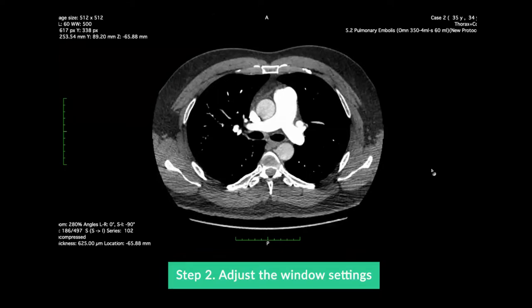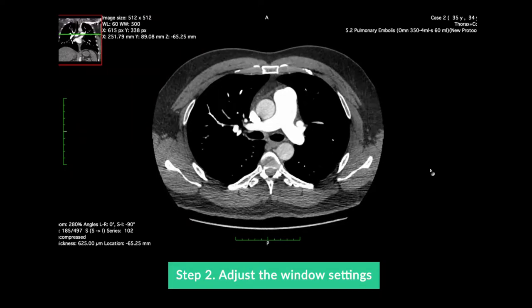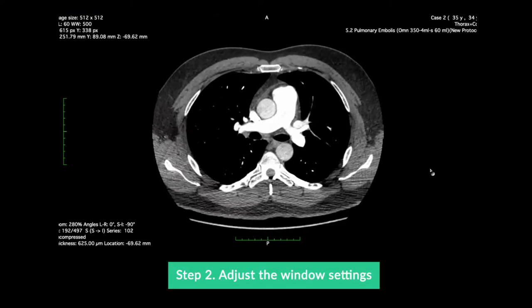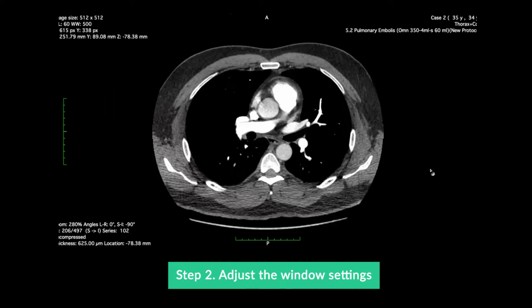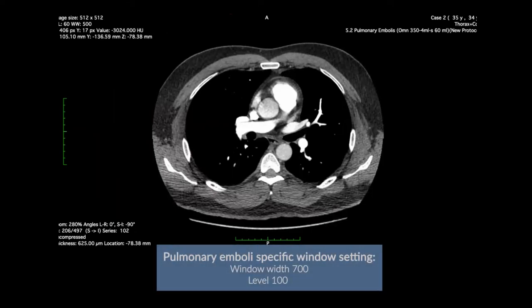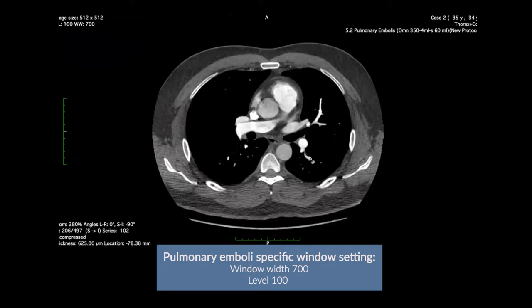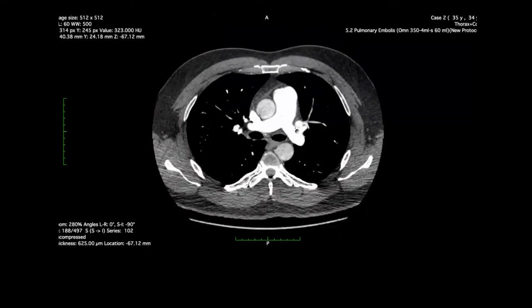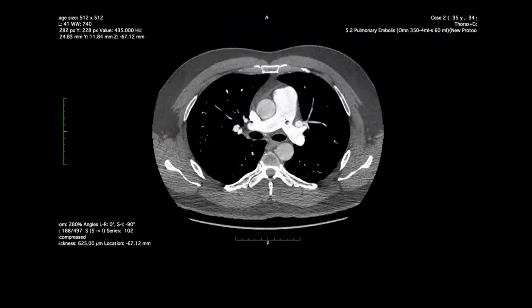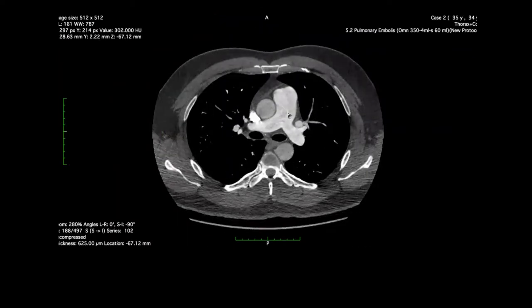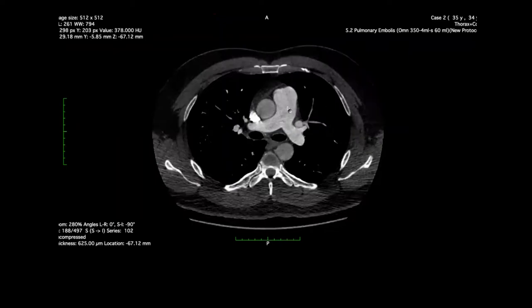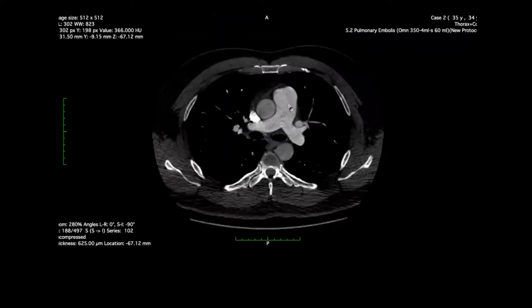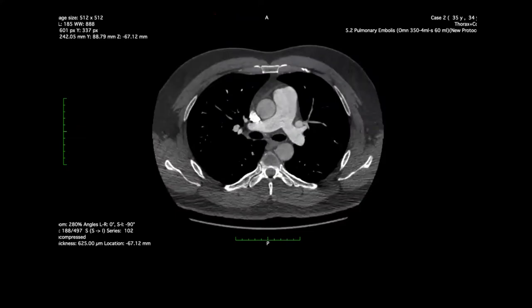The next step is changing the window setting, as if the contrast is too bright within the vessel, smaller or low density pulmonary emboli can be obscured. Some advocate that a pulmonary emboli specific window setting can be used, or we can just manually adjust the window so that the contrast is not so bright and we can see through the contrast. Right click and drag the mouse to change the window. And now we can start to review the case.